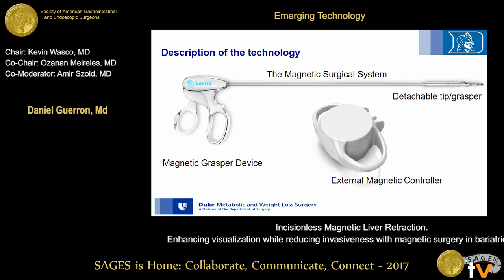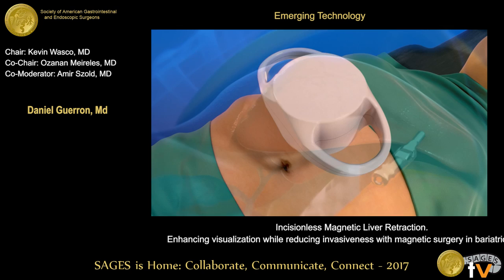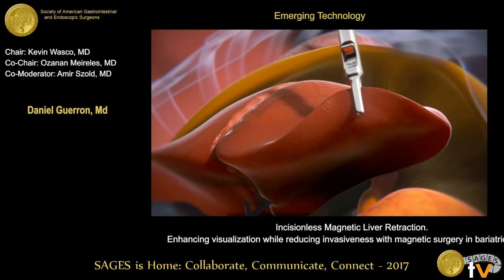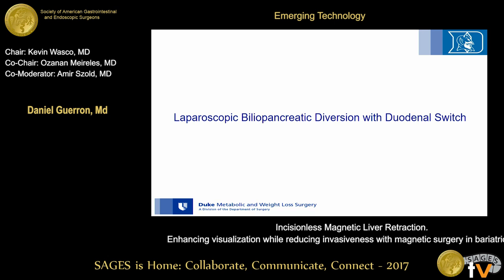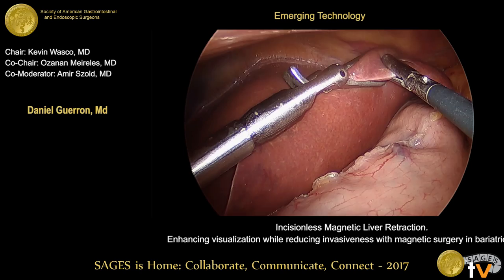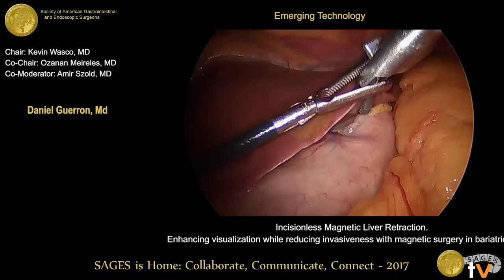This video demonstrates the concept: the grasper enters the abdomen, attaches to the liver, and with the external magnet on the abdominal wall we create attraction, thereby creating enhanced visualization and retraction. For the duodenal switch, the grasper is entered and grabs the liver. The tip is detached and manipulated such that it will be in contact with the anterior abdominal wall. The external magnet is then coupled and retracted.